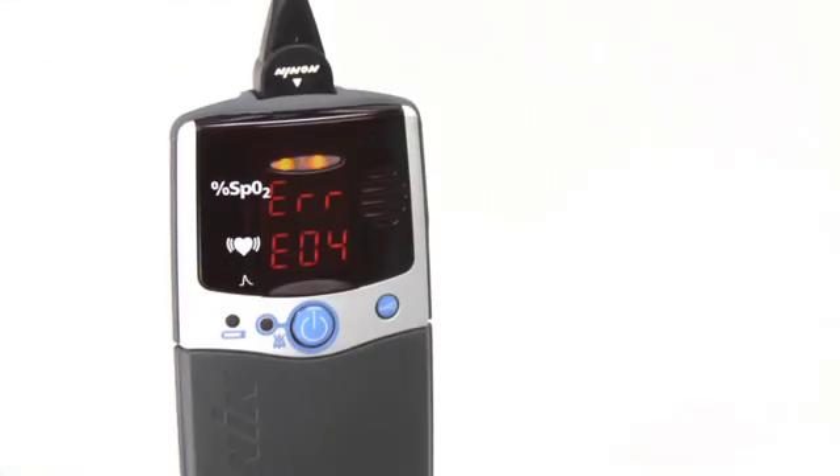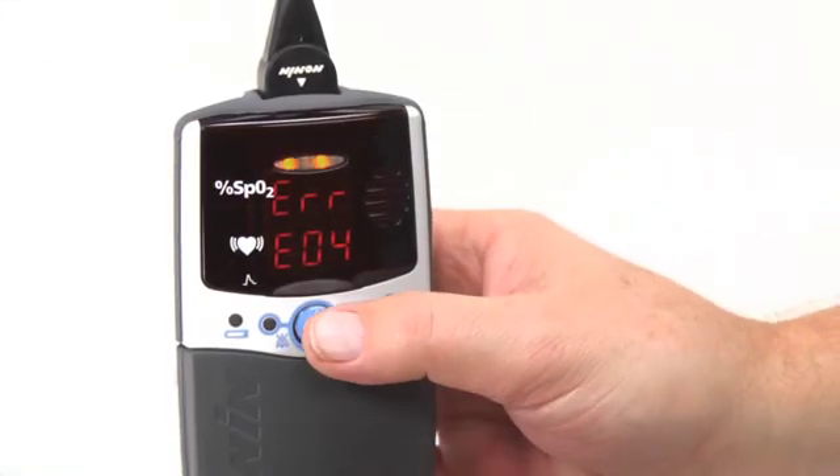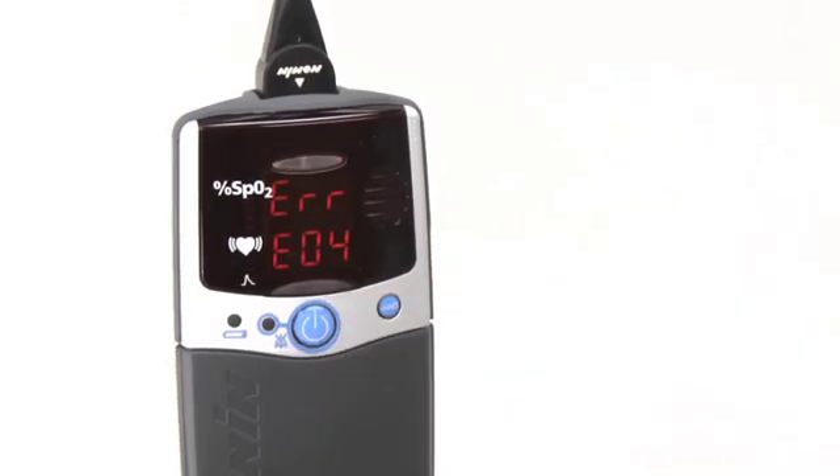Other alarms may occur on the oximeter. You can silence the audible alarm with the on-off button. Immediately notify your clinician or technical support contact.